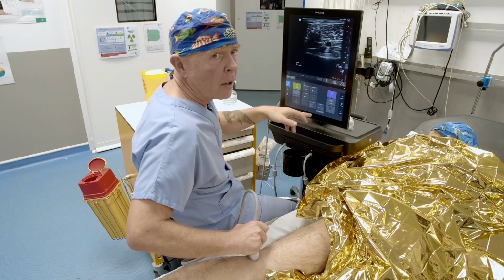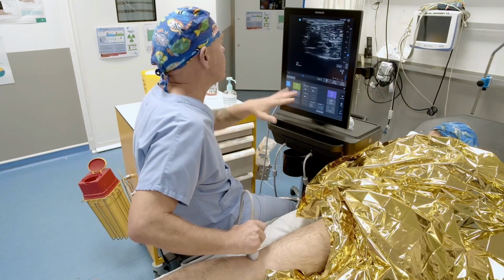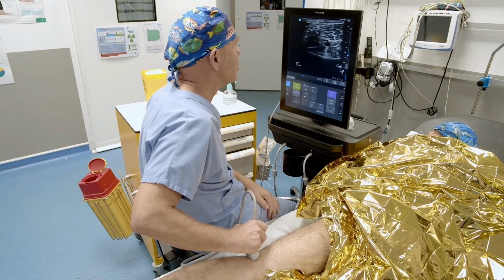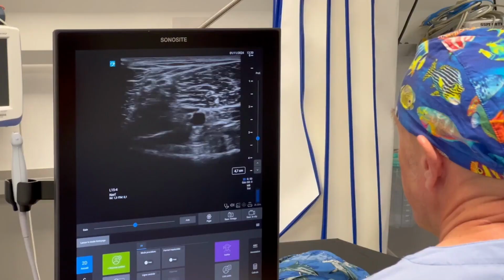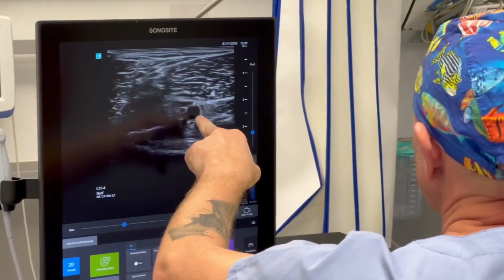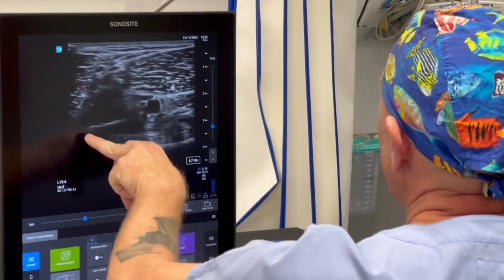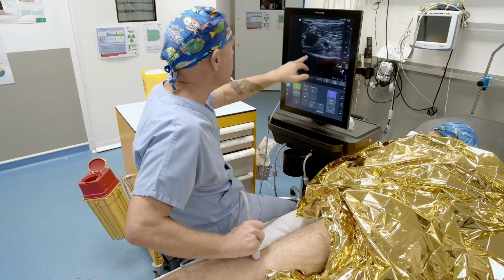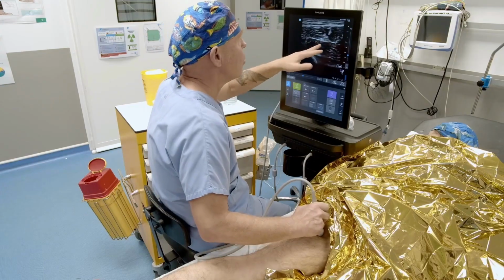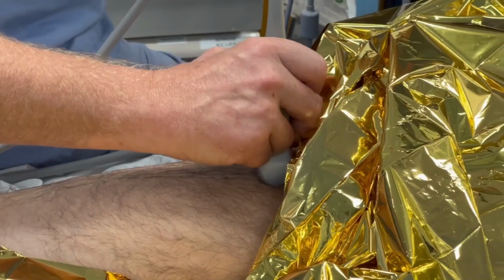If you want to do an IPACK, I absolutely did not include this type of block in this version of the book. But the IPACK would be an injection under the popliteal artery. It would be at this level along the condyles. So that's it for the sciatic block. Remember this image, the sciatic block via the subgluteal approach.